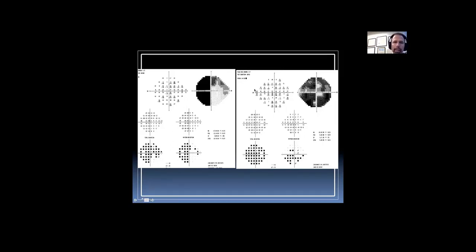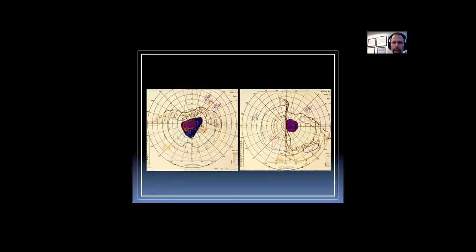approaching the chiasm and including the chiasm, but you're just getting the temporal fibers that are coming over from the other side. So this is sometimes called an anterior chiasmal syndrome, where you get one nerve and the crossing fibers from the contralateral side. Sometimes it's called the anterior chiasmal syndrome, sometimes a junctional scotoma, sometimes a syndrome of the distal optic nerve. They all mean the same thing. So very good to those of you who got that one right. So let's look at another visual field.